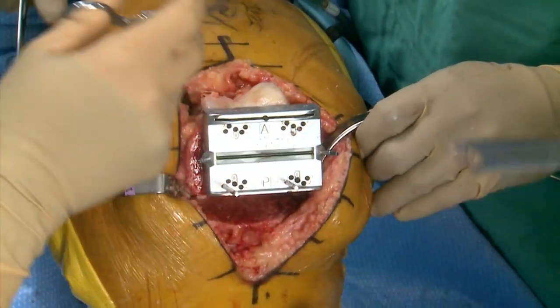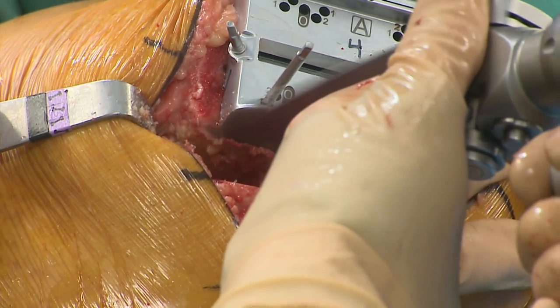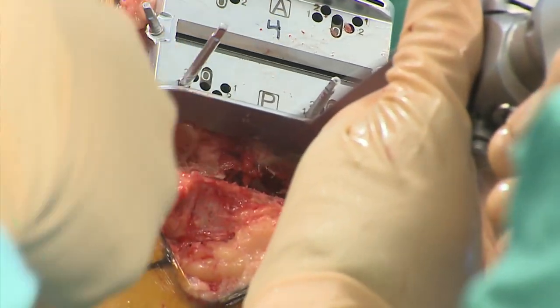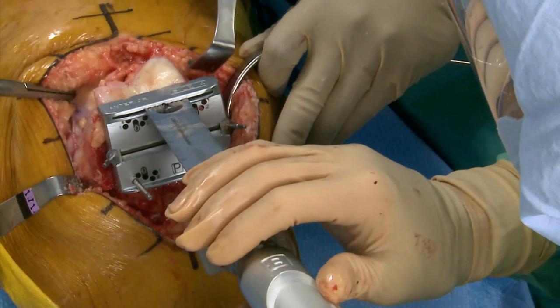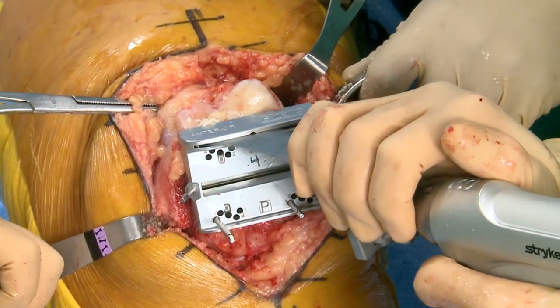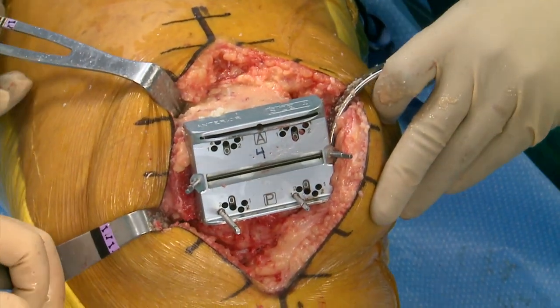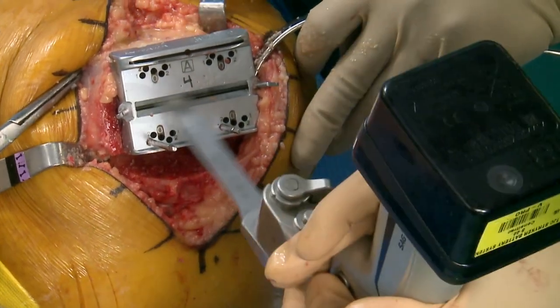Translating up one millimeter means I need to re-cut posteriorly — just one millimeter, not quite like the robot which is half a millimeter. Posterior done, now we'll move on to the anterior cut through the slot. That makes me feel good — we did not notch. I switched to a thinner saw blade for the chamfer cuts. We'll do the anterior chamfer first.